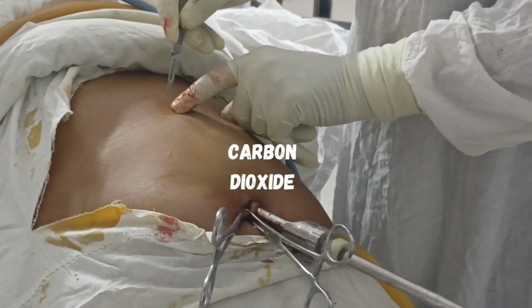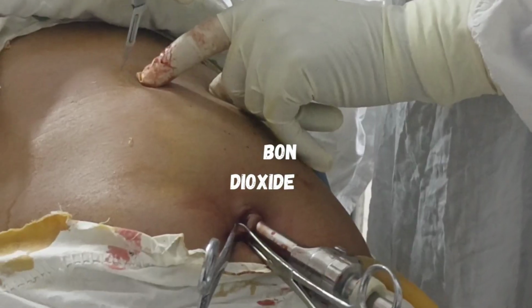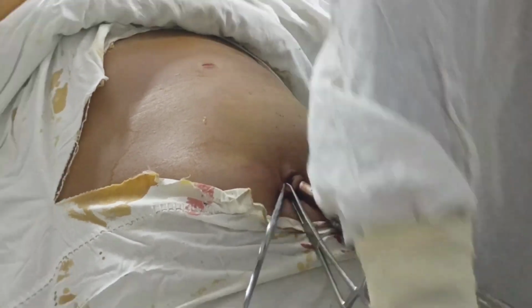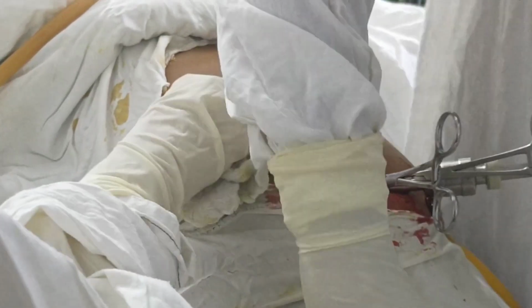If there is a leakage, the carbon dioxide will leak from that port side, and that will cause the loss of pneumoperitoneum. Another port is created just below the xiphisternum for the working of the instruments. This is known as the working port. In addition to this, a third port is also created, but before that we have to pass the camera through the camera port or subumbilical port so that we can have a better visualization of the peritoneum when we are passing the trocar for the port.